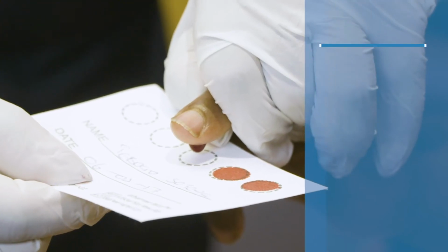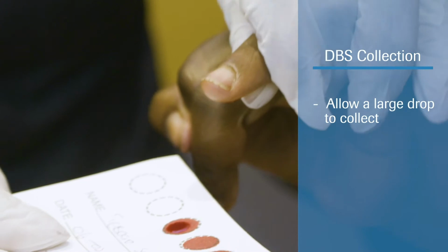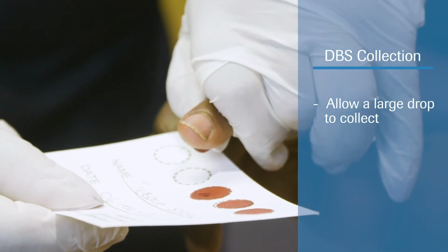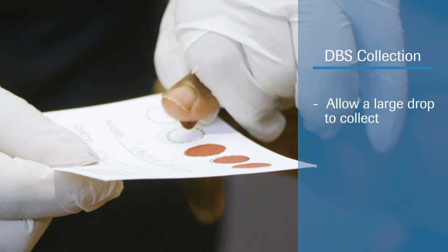Hold the finger pointed down, allowing a large drop to collect before placing the drop on the card. The finger should not touch the card directly. If your first drop is too small, you may put additional drops until the spot is completely filled before you move on to the next spot.